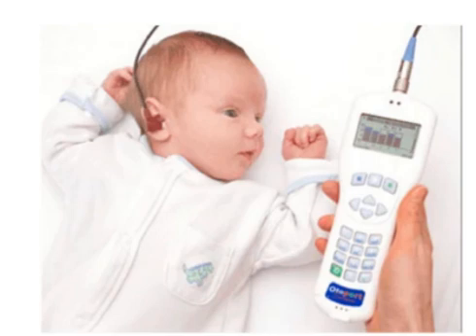DPOAEs are more sensitive to the higher frequencies, which are commonly affected first in ototoxicity. Prior to starting ototoxic medications, patients should undergo baseline OAE testing and again with each dose of ototoxic medication. Changes of 2.4 decibels or more are considered a significant decrease and indicate a change in cochlear function.